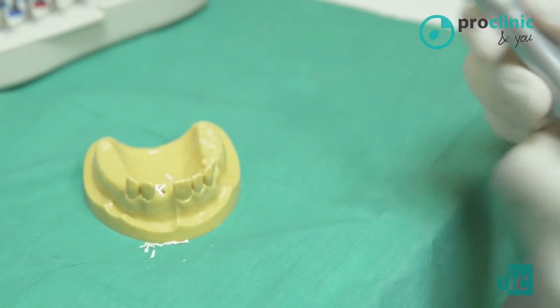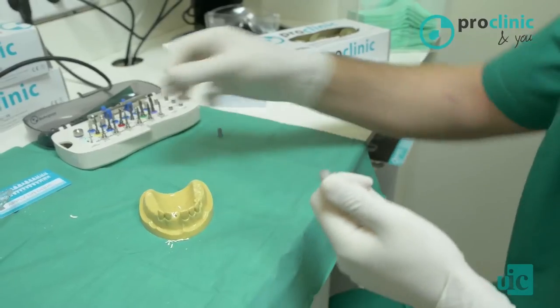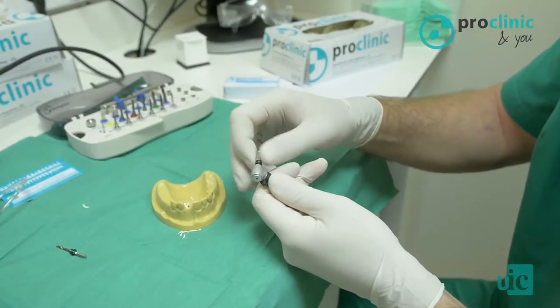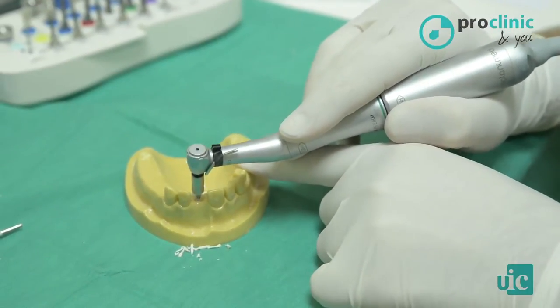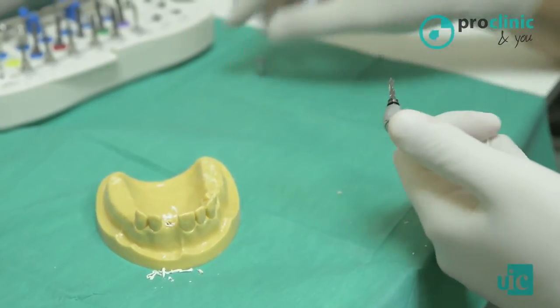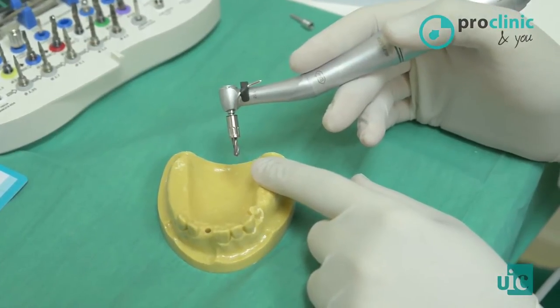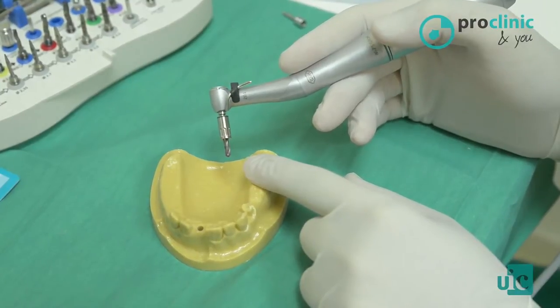Once the first helical burr has been used, what we have to do is to remove the drill stop device and change to a bigger helical burr. Then we place the drill stop device again to continue drilling. Now you can see how drilling becomes easier, because the implant bed diameter is being increased little by little. The drilling sequence to place an implant of 3.75 millimeters of diameter ends at the 3.1 millimeter diameter burr.